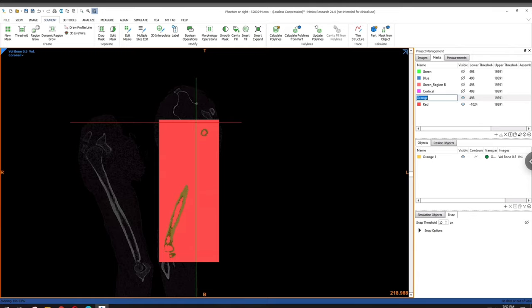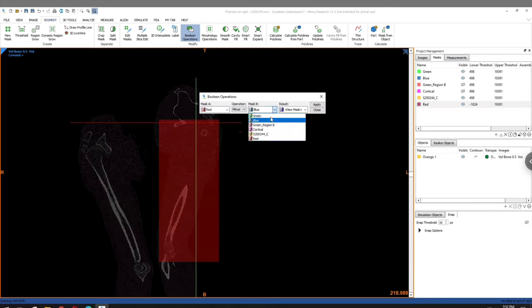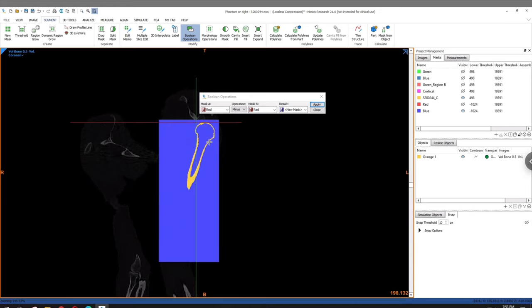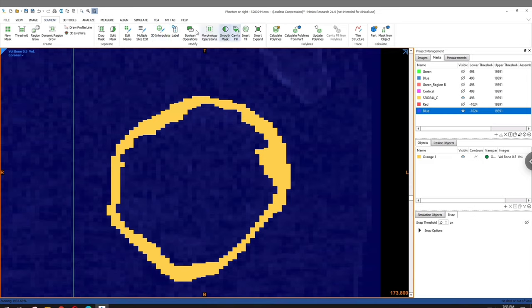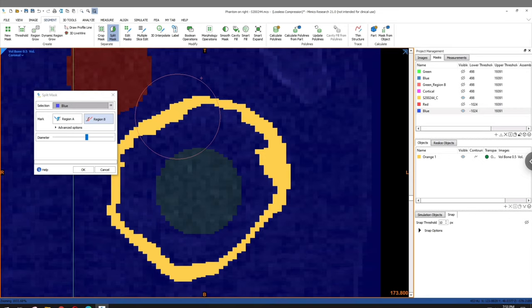with a mask. What we're going to do here is treat everything inside the cortical shell as trabecular bone. Once you have completed filling in all of the negative space, I perform a Boolean operation here, and I'm just going to subtract my cortical shell from my new mask. This will allow me to use that split mask function once again in order to differentiate between the internal structure and the rest of the mask externally to my cortical shell here.